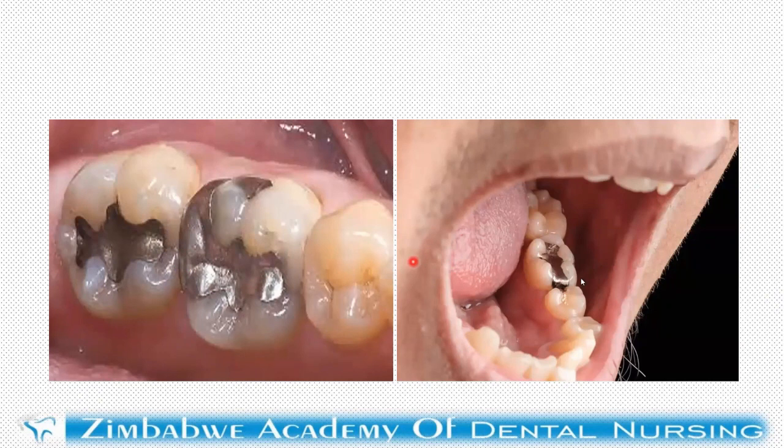On your right, in the mouth, you can see also a nicely done amalgam filling on a molar. This is lower left of this patient who's opening his mouth. So that's dental amalgam. And the job of a dental assistant is to mix this material for the dental therapist or the dentist so that they can pack it and carve it and polish it nicely like this.